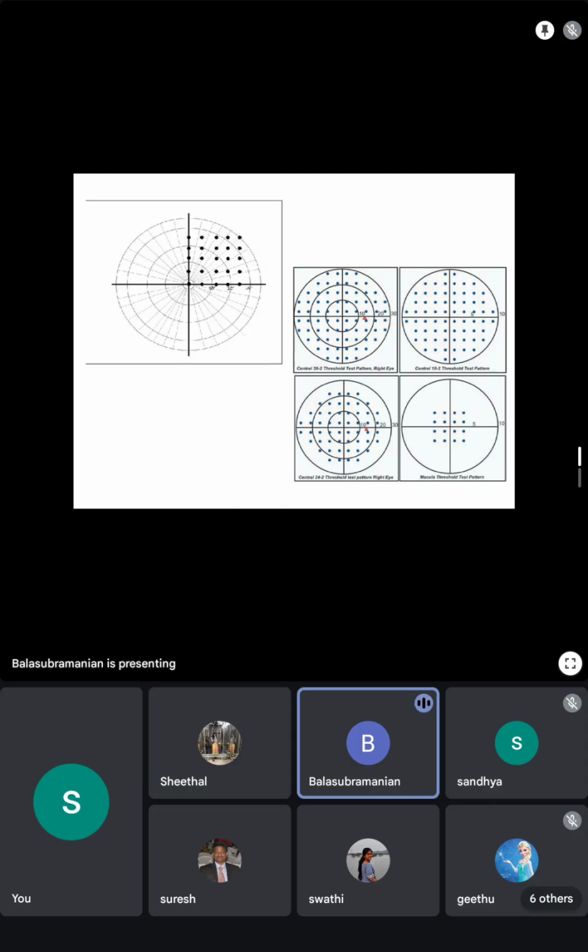Is it our preferred mode for testing? No, ma'am. We prefer 30-2. Then why? In most of the charts, the first chart you read is 24-2. You will mostly see only the -2. There has to be a reason for that. Why not -1 and why -2?